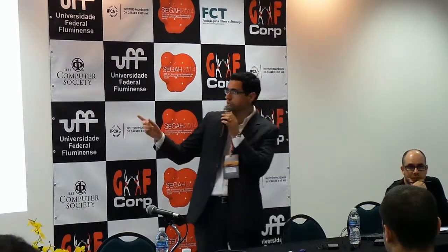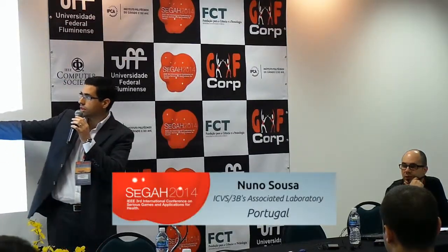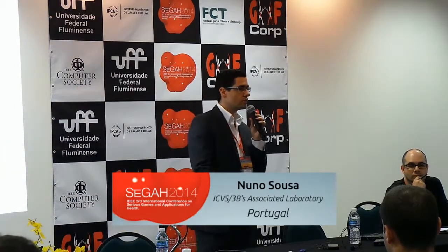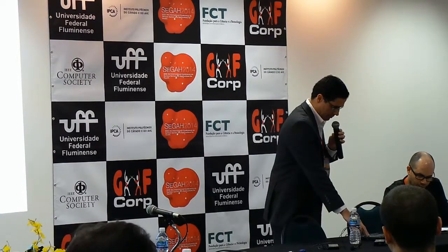So, regarding the system architecture, what you have here is mainly the sensing part of the system, which are the dry electrodes. Then you have the converter, which is the analog-to-digital converter, converts analog signals into digital signals. And then you have the platform itself, the single board computer system, where we had to develop a driver, a software part that is actually dealing with the converter, and the central processing and transmission unit, which is really the core of the system and is supposed to deal with data and transmission at the same time.